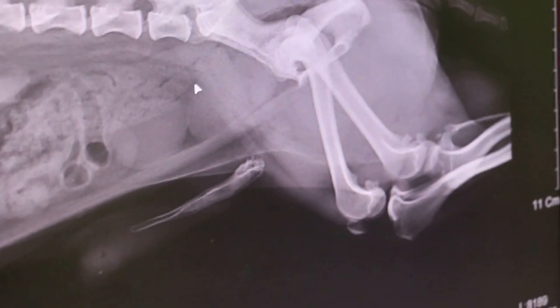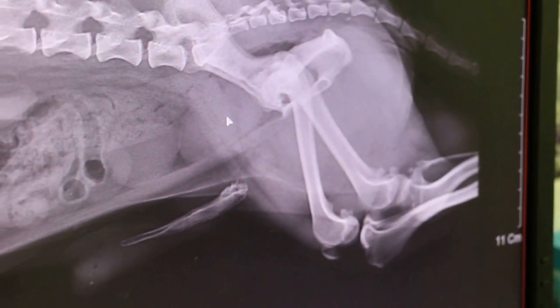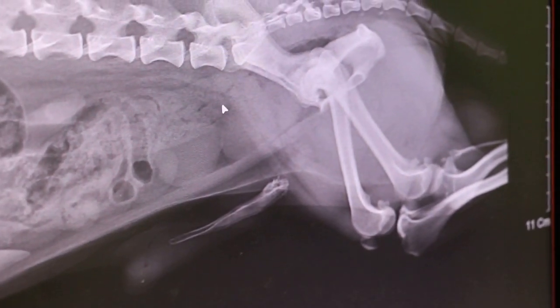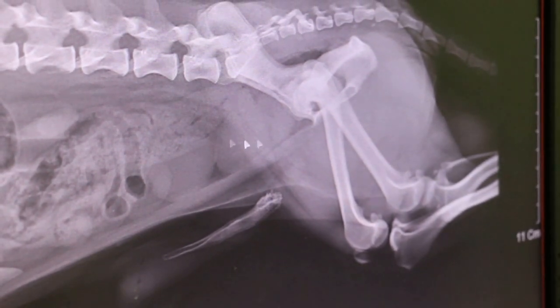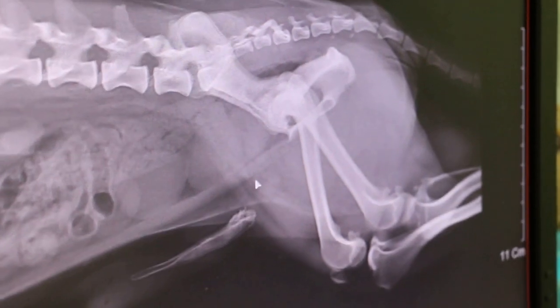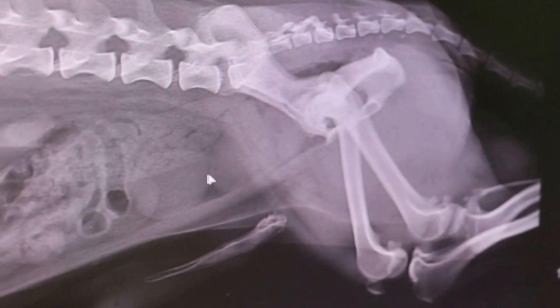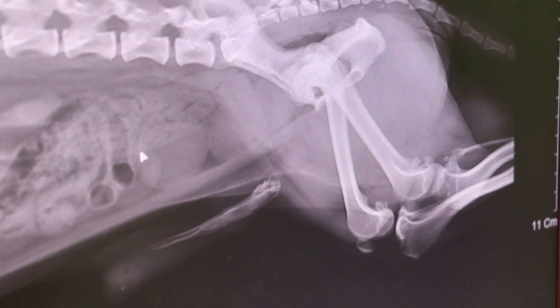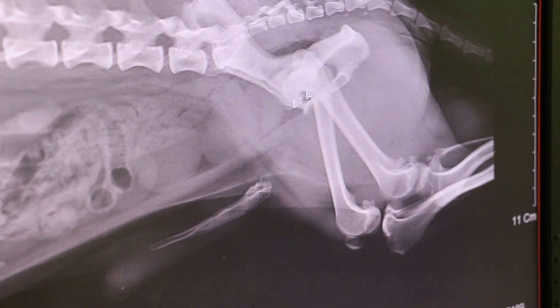The prostate normally you can't see at all, but now you can see it clearly. If the dog is neutered, sterilized, or castrated, there won't be any enlargement, because it's normally due to hormones and testosterone. So this is prostate enlargement. The blood in the urine could be due to prostate inflammation as well as bladder inflammation. That's why the dog dribbles blood in the urine — blood in the urine now and then.